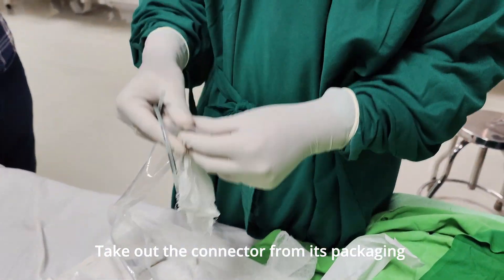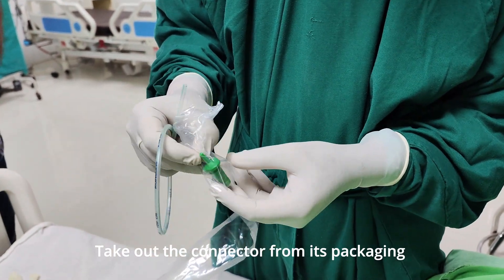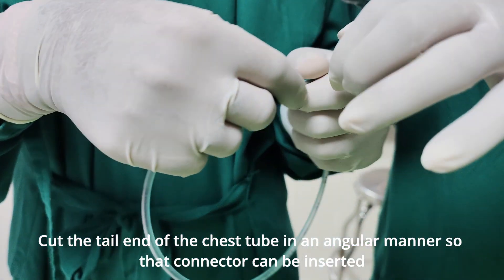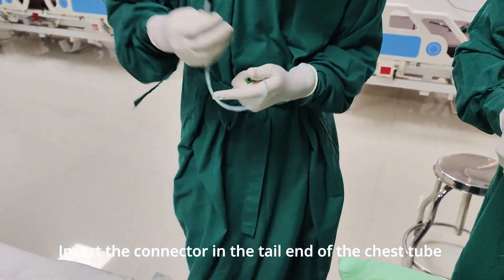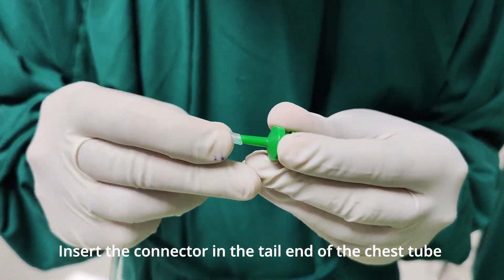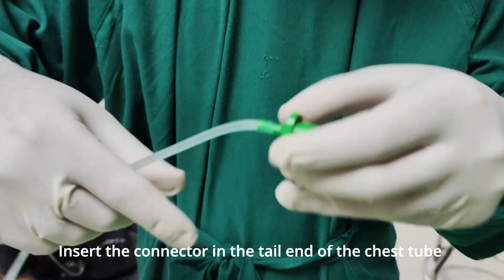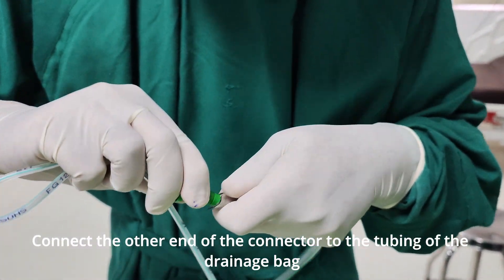Take out the connector from its packaging. Cut the tail end of the chest tube in an angular manner so that the connector can be inserted. Insert the connector into the tail end of the chest tube, then connect the other end of the connector to the tubing of the drainage bag.